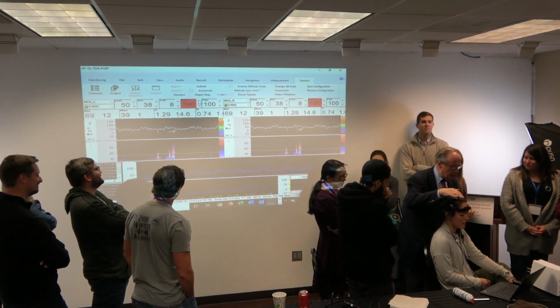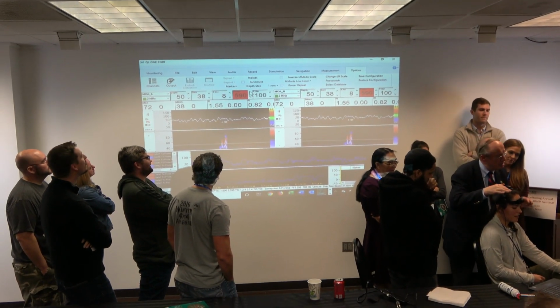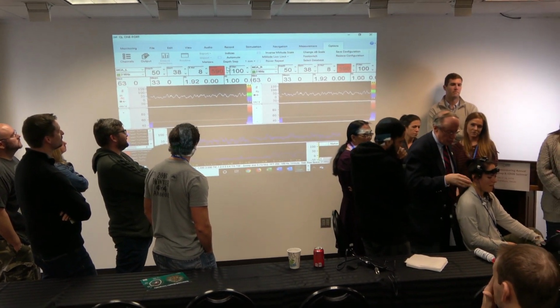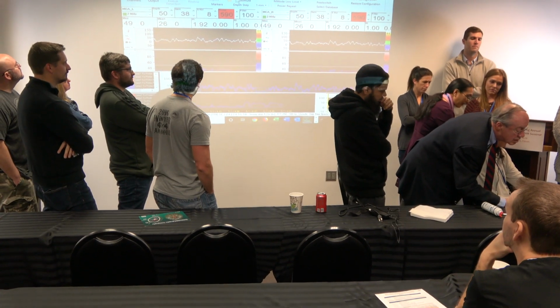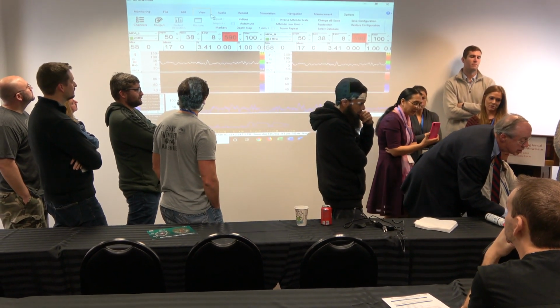As you can see, we have a relatively big sweep time, better to change the sweep time, lower.